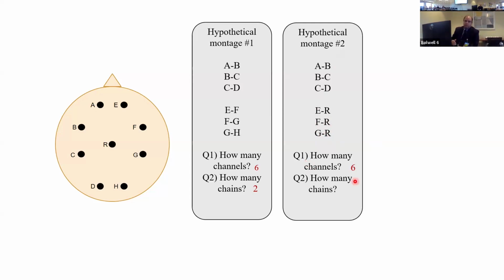In reality, there is no reference which is totally indifferent. That's impossible because as long as your electrode is somewhere on the head, it'll pick up something. But you pick, for example, if I'm interested in localizing a sleep graphoelement, which I know is maximum in the midline, I should probably pick a reference which is distant from it, for example, the ear, so that I get minimum contamination from that. But in reality, there will be no reference which will be totally quiet. Okay, that's impossible. So there are two chains here, but different from the first one. One is bipolar, one is referential.